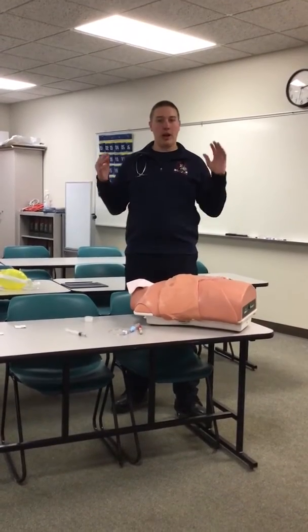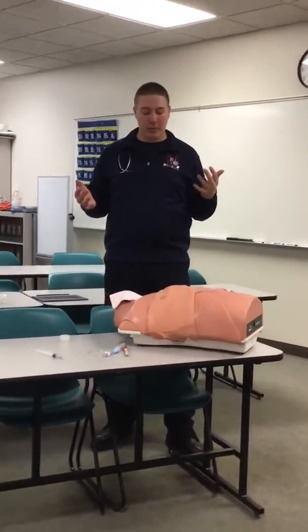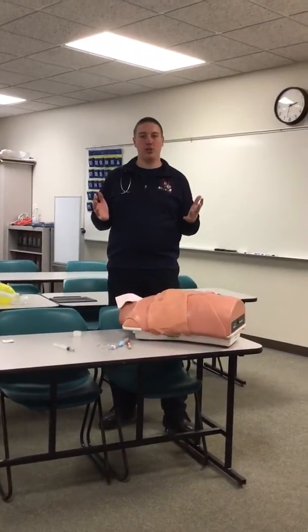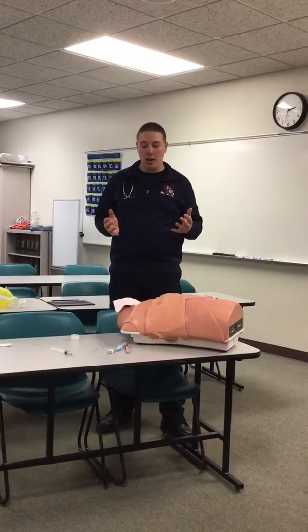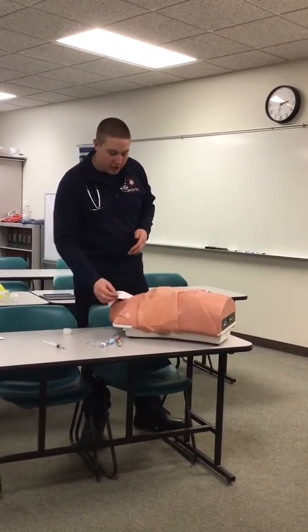So to start, we'll have our PPE on, gloves for sure, maybe eye protection, but you want to make sure you have your correct PPE on. To start off with, we're going to find our site.